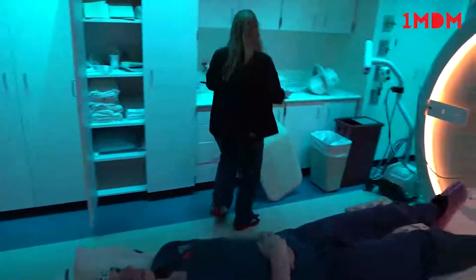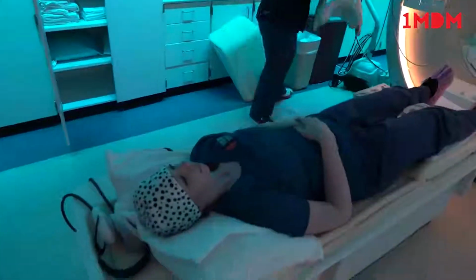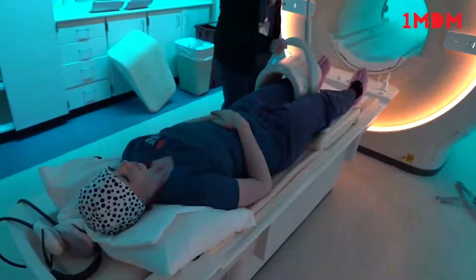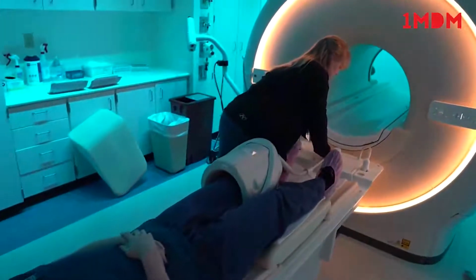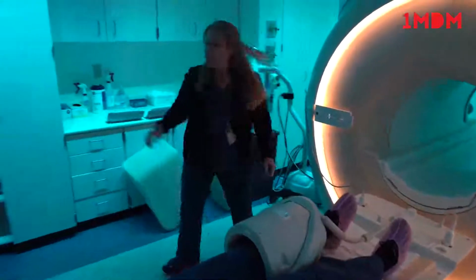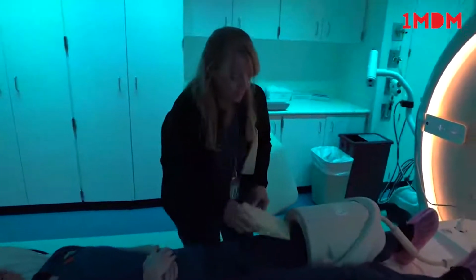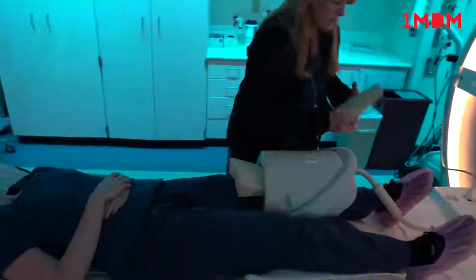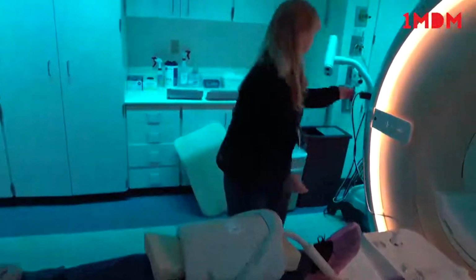We're going to put a coil across the top. This coil will act as the antenna to receive the signal the machine makes, all the noise, and this receives it. So very important to keep your knee super still through the whole exam. Try not to move it. It's about 20 minutes. These sponges are just going to help you hold your knee really still for me.